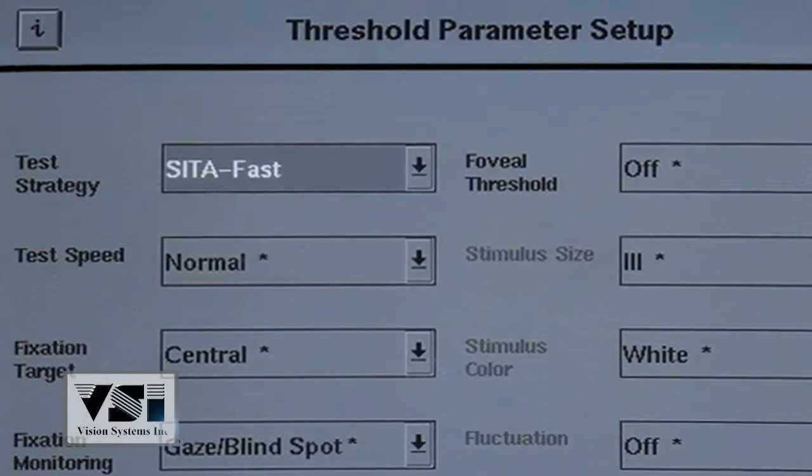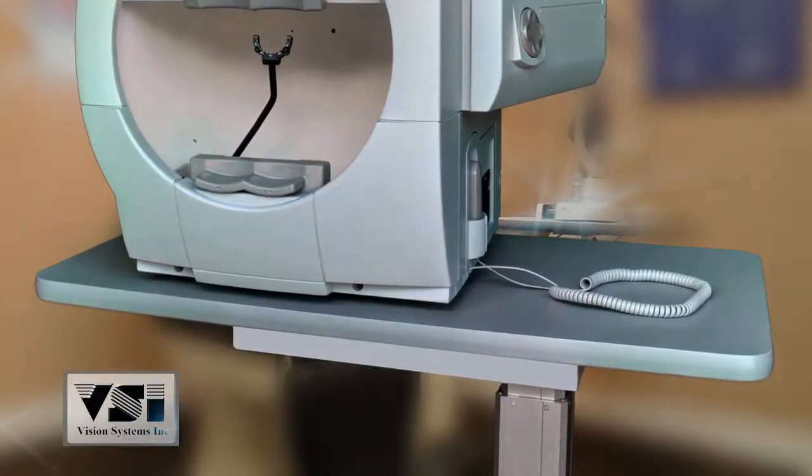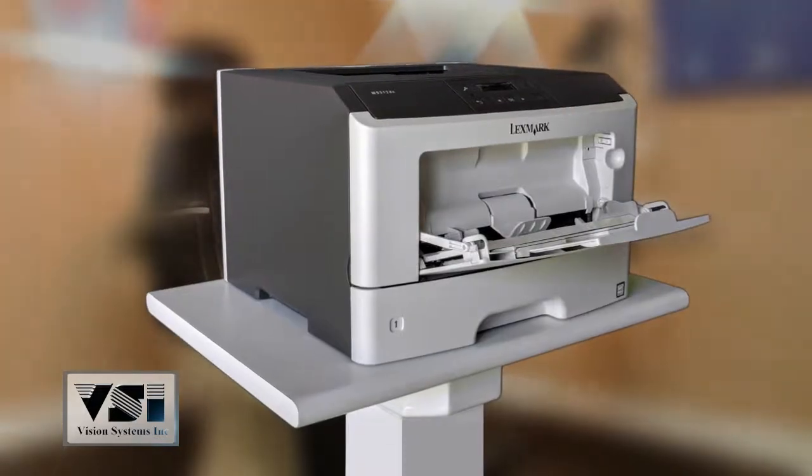SITA Fast can be preset or chosen at the time of the test. Includes power table and upgraded laser jet printer.